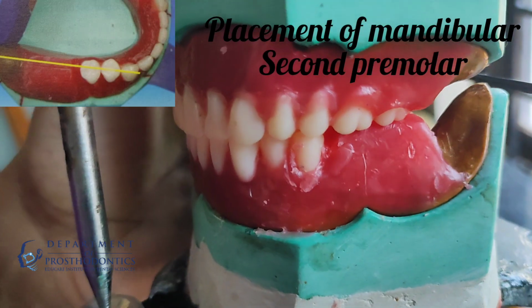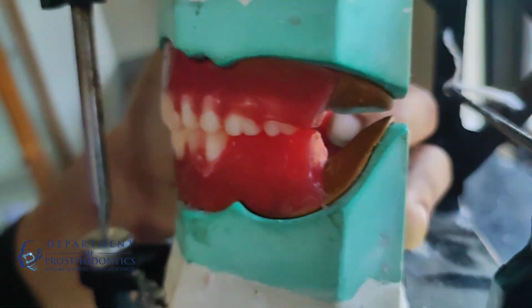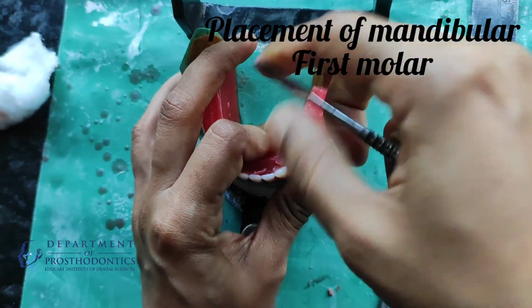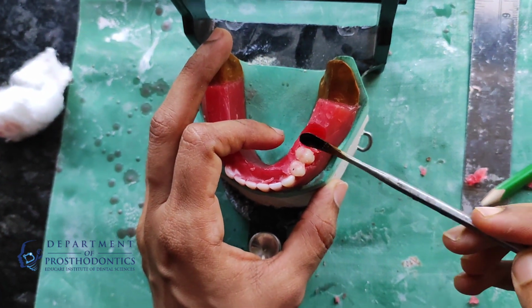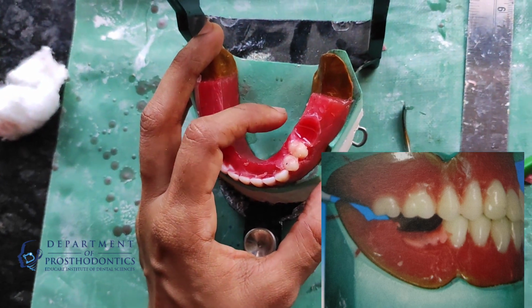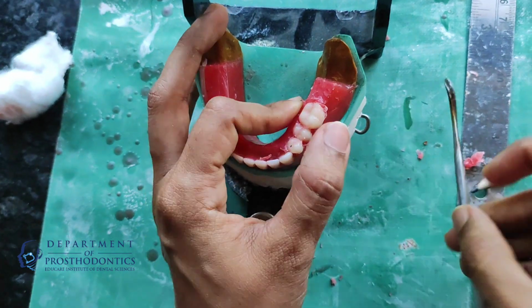Mandibular second premolar is placed between the maxillary first and second premolar, which is parallel to the vertical axis when viewed from the front. The lower first molar is placed below the maxillary first molar. The mesiobuccal cusp of the maxillary first molar should rest on the mesiobuccal groove of the mandibular first molar. The mandibular first molar is slightly lingually inclined.